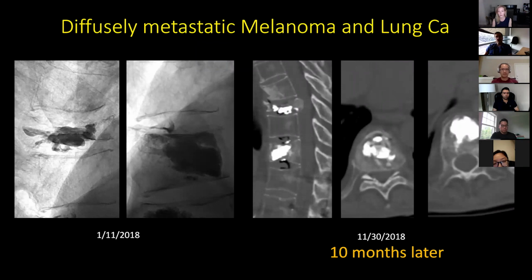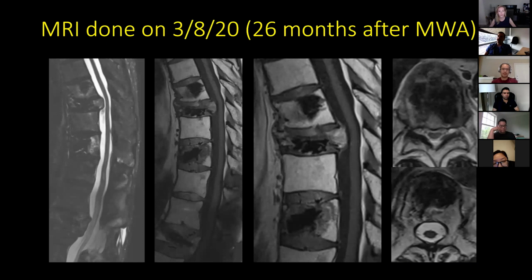There is no retropulsion of the posterior cortex more than what it was before our intervention. And this we just scanned him a couple of months ago. This is almost 26 months later now, and you can see that it's exactly what it was initially.